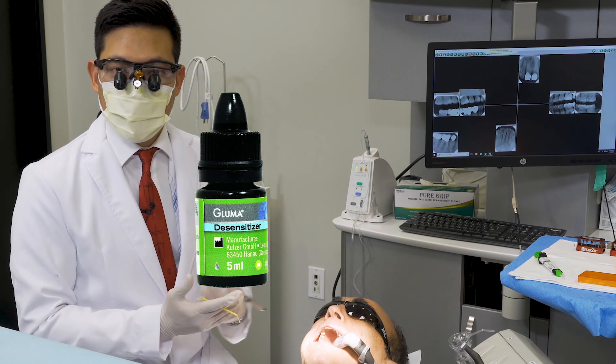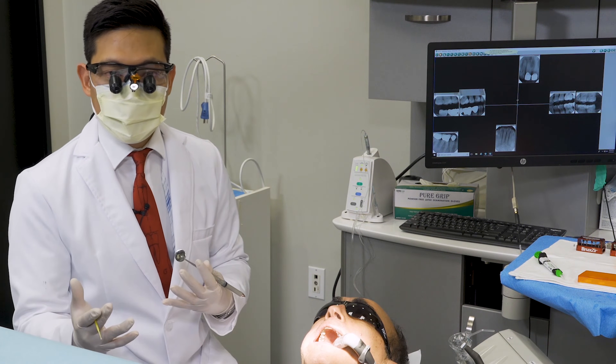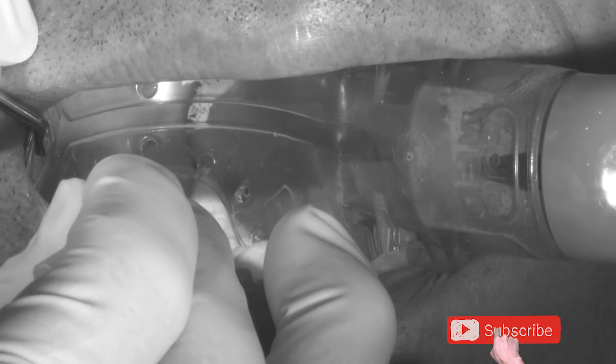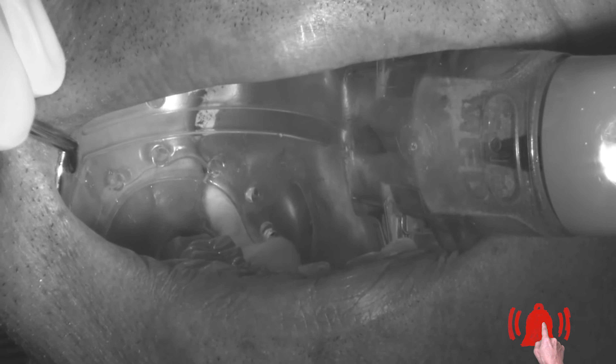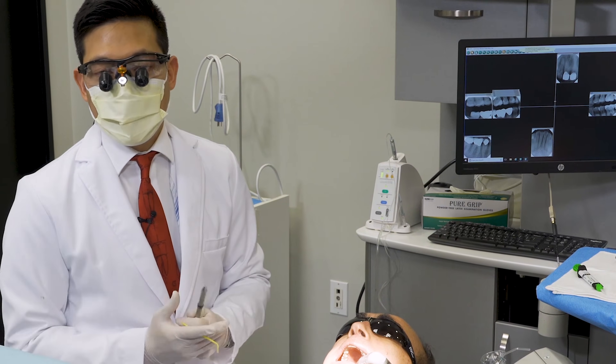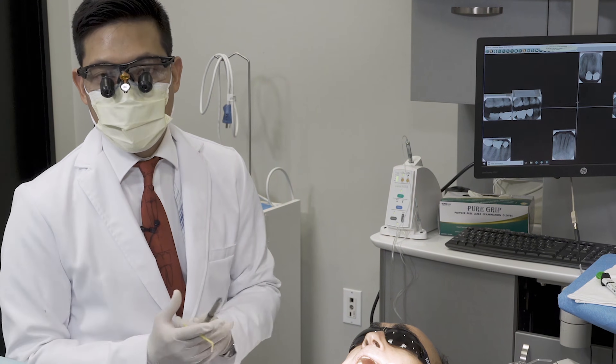In this case, I use Gluma. Gluma is a glutaraldehyde and HEMA solution. The combination of that has been shown to greatly reduce the risk of post-op sensitivity. It also has a nice antimicrobial action as well to help clean the preparation.